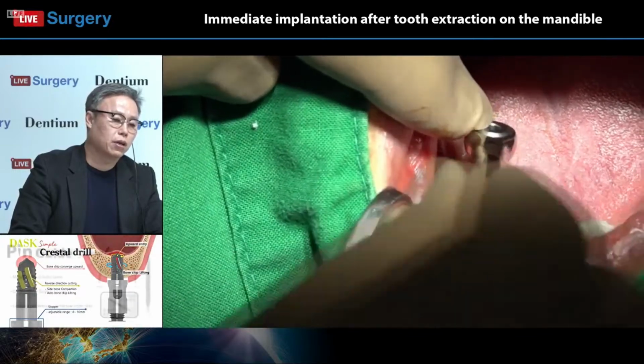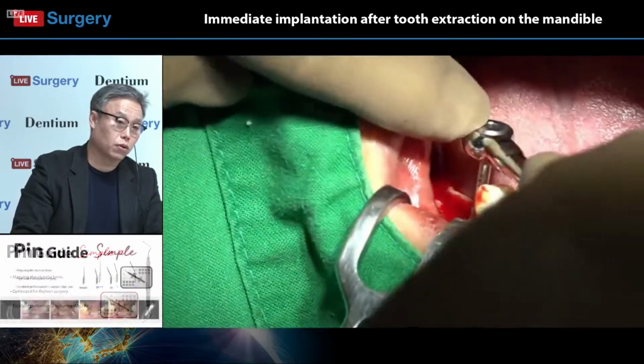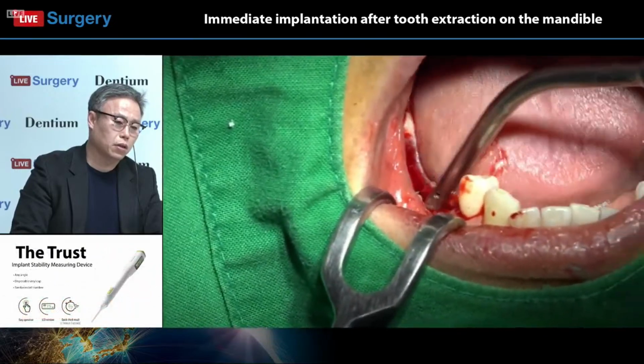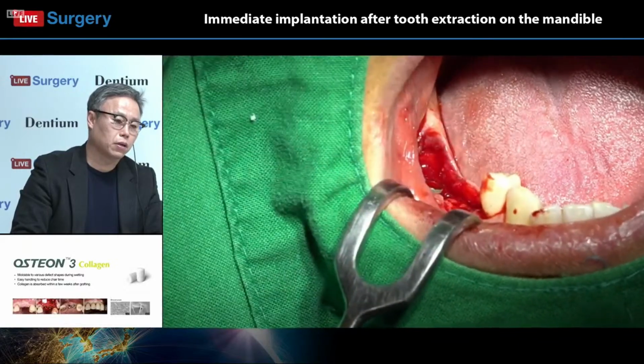use the reverse torque on screen. Clockwise. Checking the depths.